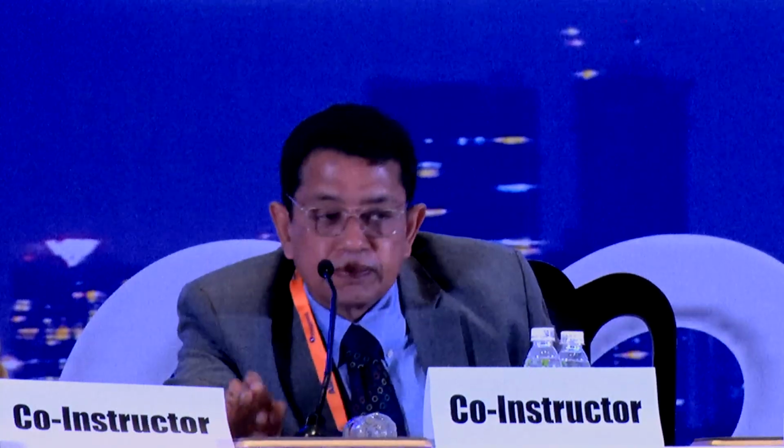Single tip, my topic was on intumescent cataract. Whichever way you do it, make sure that the intralenticular pressure is less than the intraocular pressure or the anterior chamber pressure, whether you do it by evacuating lens material from the bag or by using cohesive viscoelastic to depress the capsule. As long as you have a flat capsule, the tendency for the rhexis to run off is less.